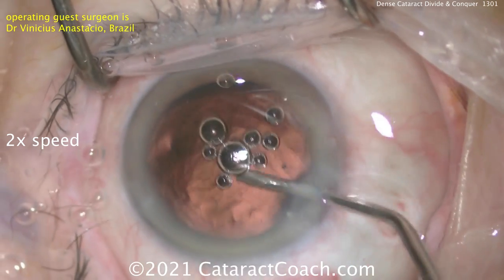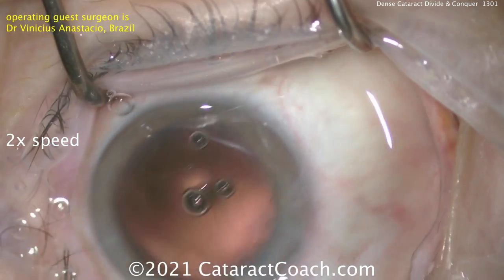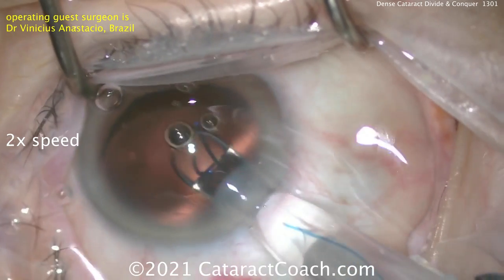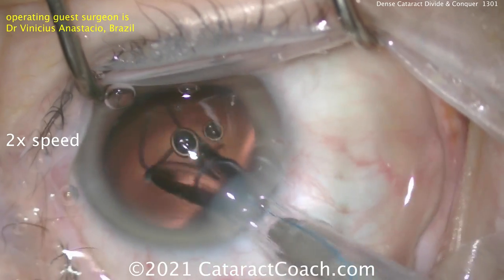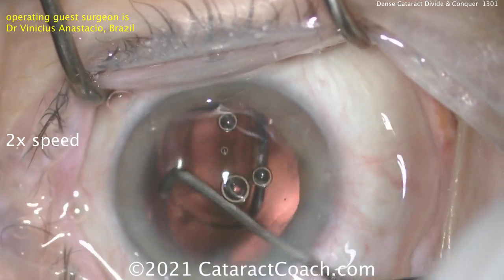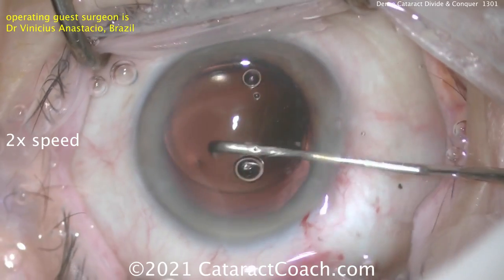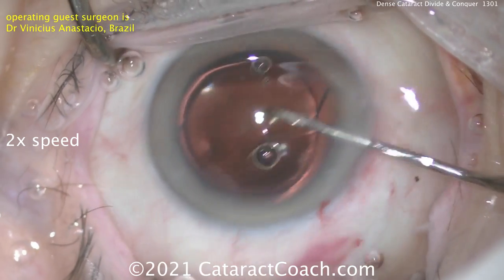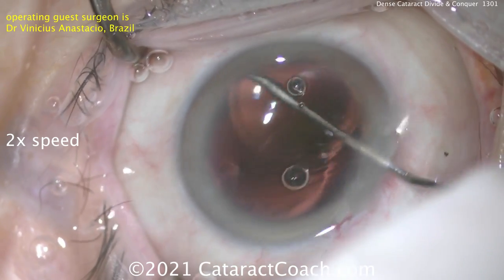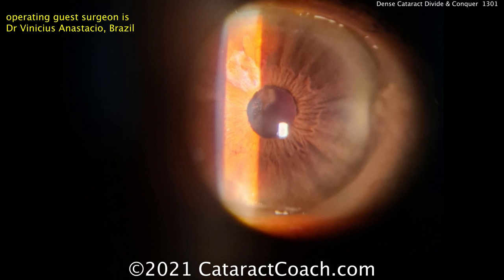Here's the viscoelastic — get the lens in the bag next. And I have a treat for you: he was nice enough to send in a post-op photo. What do you think the cornea looks like on post-op day one? Think there's a lot of corneal edema? No chance. With this technique and re-coating the endothelium two or three times with viscoelastic, this patient is going to have a beautifully clear cornea on post-op day one. Taking a patient with a brunescent cataract to sharp vision and a clear cornea the next day — that is just a pleasure.